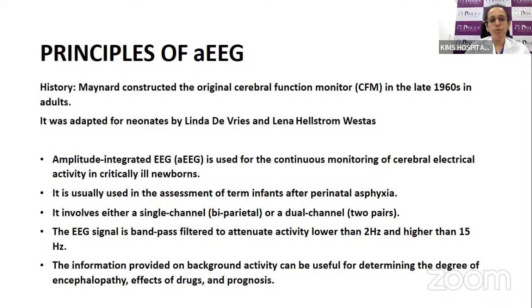These were initially used for the assessment of babies who are born after perinatal asphyxia or after any seizure activity, encephalopathy, to detect the cerebral function and to note down the frequency of the seizures and their response to the medications. In fact, administering anti-seizure medications after confirmation with the electroencephalogram is ideal, rather than treating seizures only on a clinical basis.